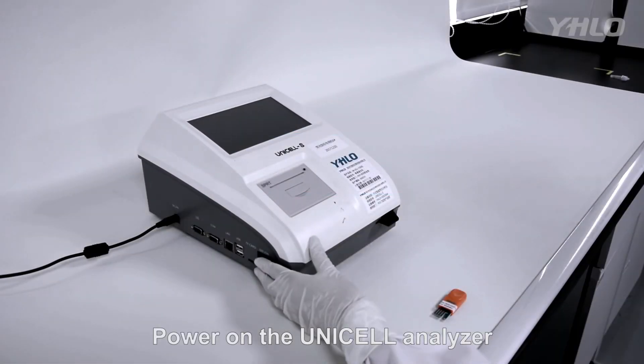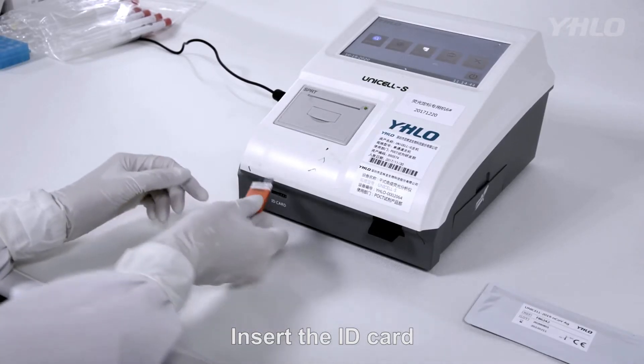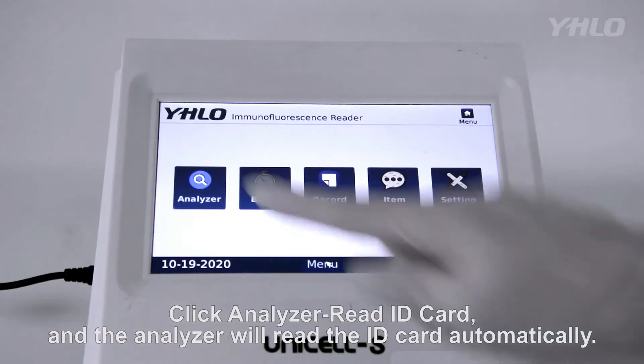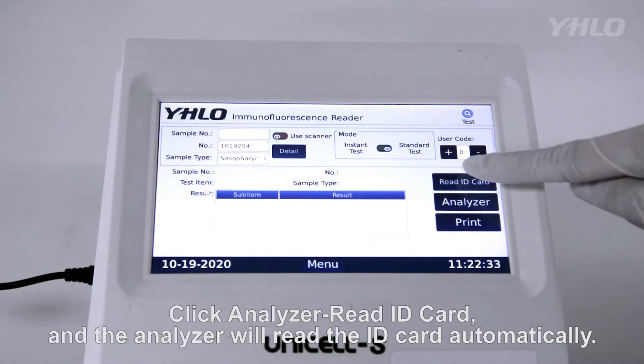Power on the Unicell S Analyzer and insert the ID card. Click Analyzer, then Read ID Card, and the analyzer will read the ID card automatically.